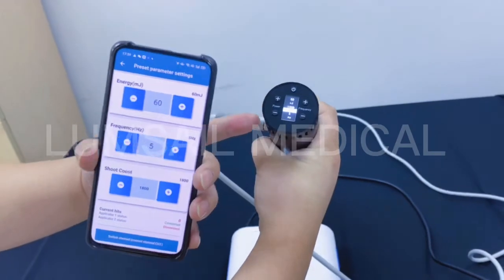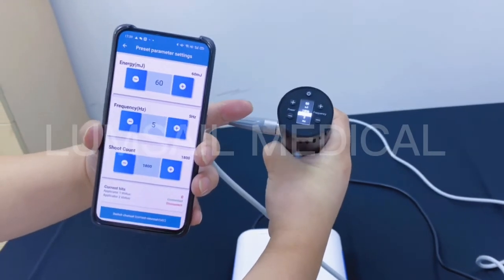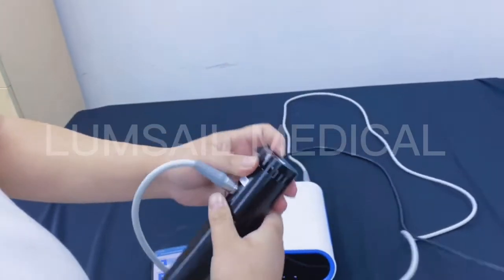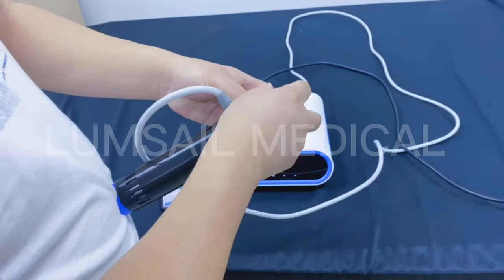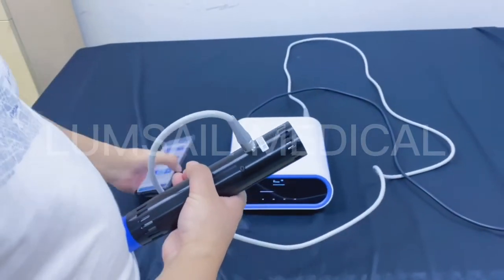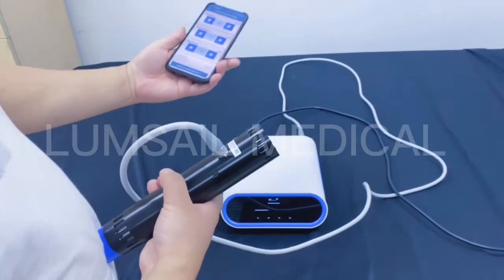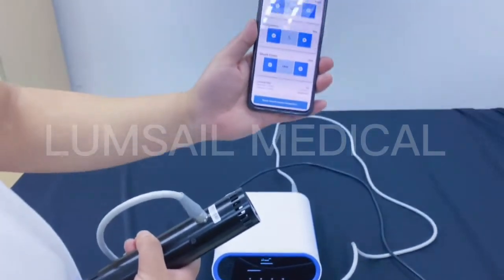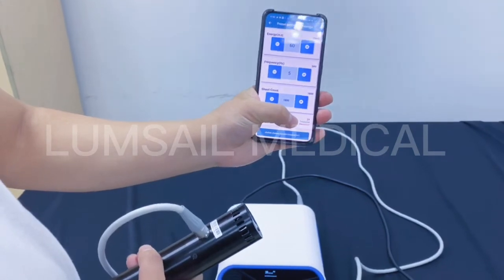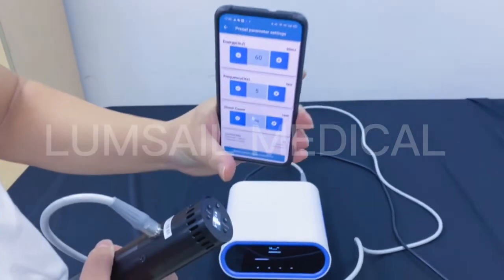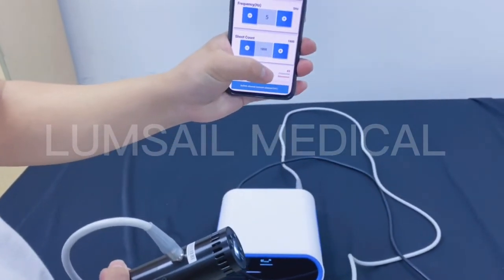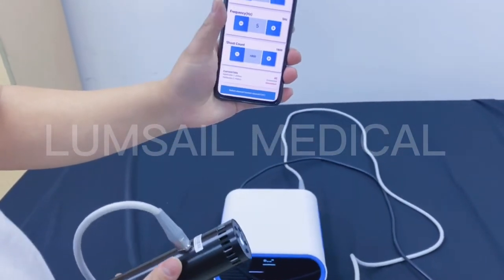Now we can do the treatment. At the same time you can see the counter progressing both on the control panel of the handpiece and on the application simultaneously.